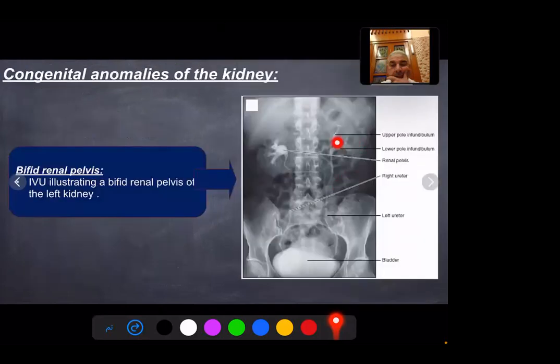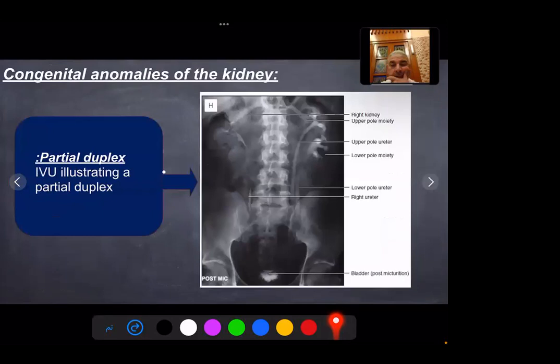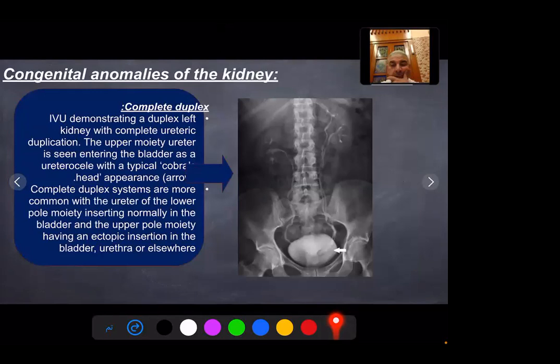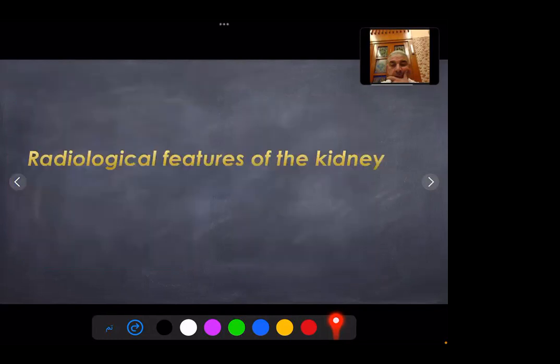Bifid renal pelvis: IVU demonstrates a bifid renal pelvis of the left kidney. Partial duplex: IVU demonstrates partial duplex of the collecting system. Complete duplex: IVU demonstrates a duplex left kidney with complete ureteric duplication. The ureter draining the upper moiety is entering the bladder as a ureterocele with typical cobra-head appearance. Complete duplex systems are more common, with the ureter of the lower moiety inserting normally in its location in the bladder, and the ureter draining the upper moiety having an ectopic insertion distally in the bladder, urethra, or elsewhere.